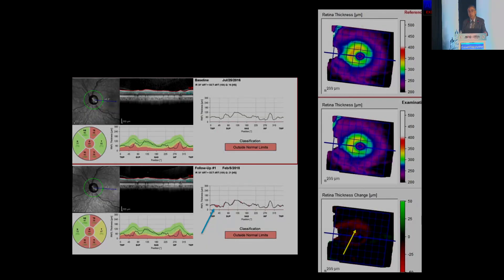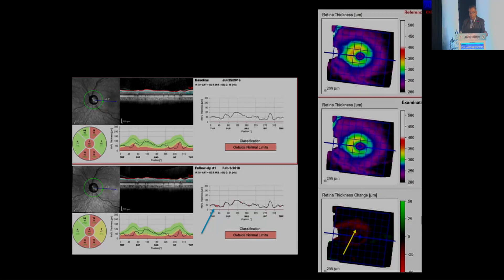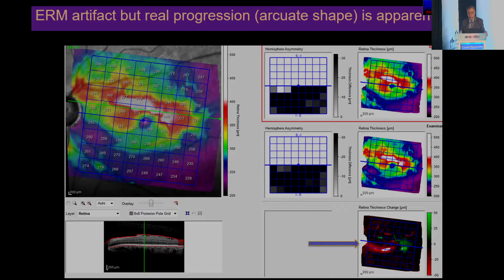In normal pressure glaucoma, the classic changes happen more towards the temporal part — more towards the fovea, right in the middle of the posterior pole — and not in an arc-shaped loss as seen in high-pressure glaucomas. In patients with epiretinal membrane, you can still see an arc-like loss; you can ignore the distortion that happens.